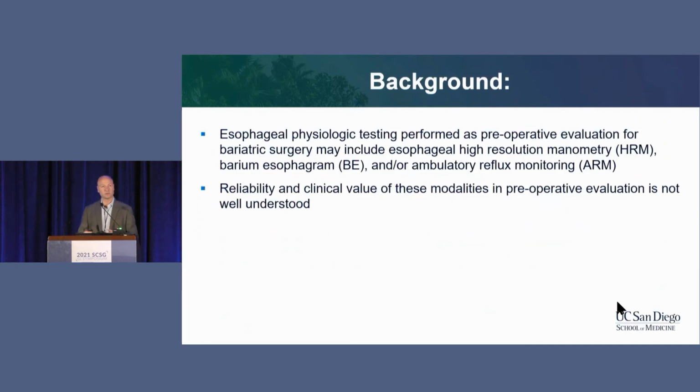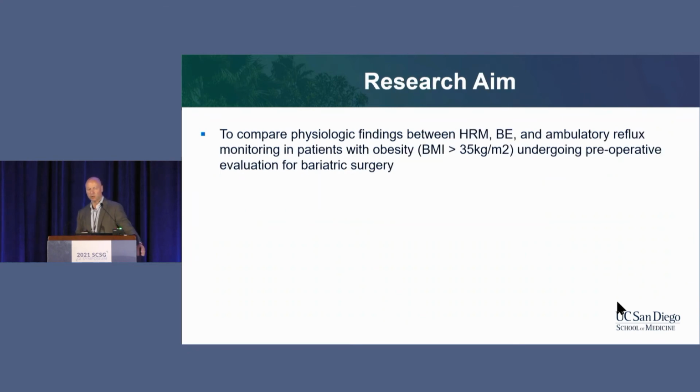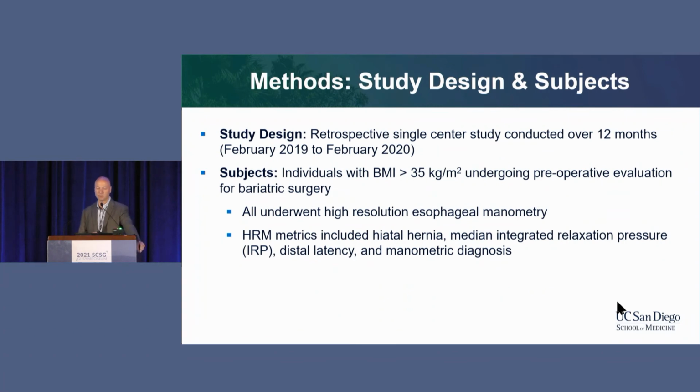So this team was very thoughtful in thinking about how we can go about this and look at the best way to work these patients up. Because maybe if we figure out if there are problems ahead of time, we can circumvent this. Maybe the people who were running into this problem and generating this pseudoachalasia pattern may be people that we could pick out beforehand. And really what they wanted to do was look at all of the tests. So look at high-resolution manometry, esophagram, reflux testing, and they were looking at this in patients who were being referred for bariatric procedures. So the study design was a retrospective study design, single center over 12 months.